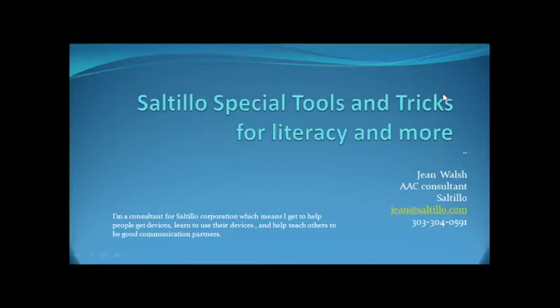I am a consultant for Saltillo. People get communication devices. I train people on communication devices, and I also train those around the people so they can be better communication partners.